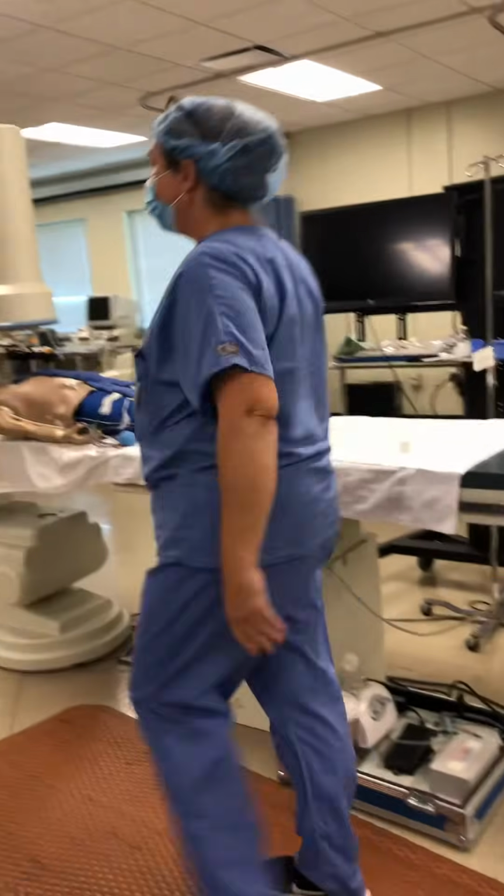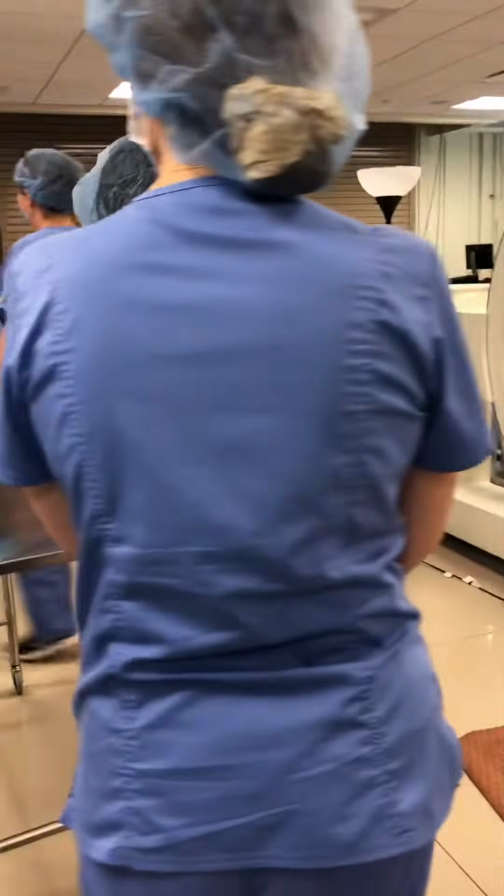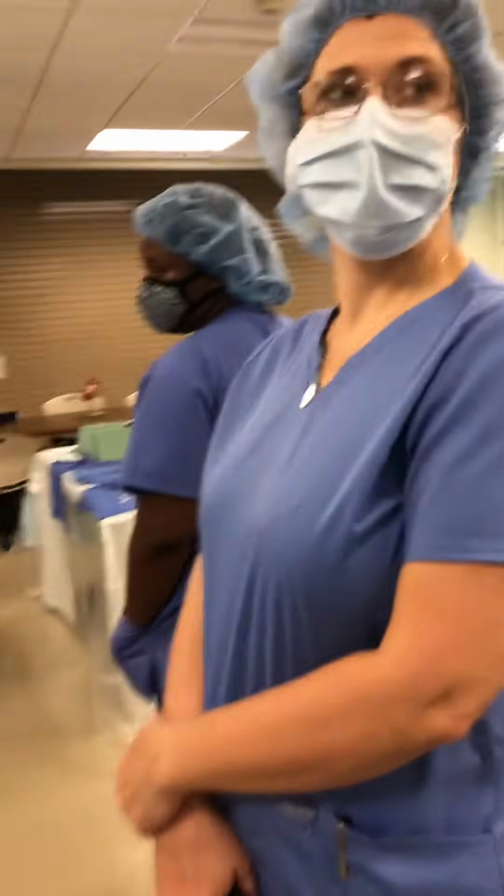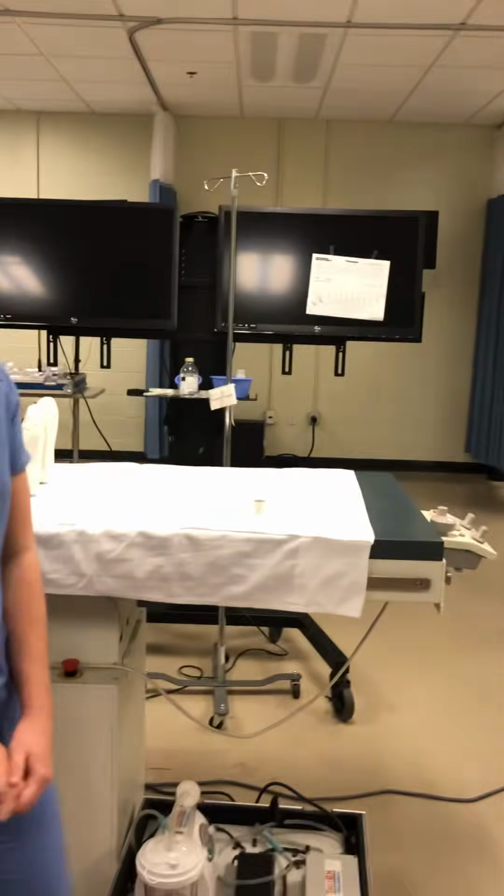Now, let's come on back here. Do I have a volunteer to let me Doppler your pulse in your foot? Tia wants to do it? Okay, Tia. I want to know what that was like.